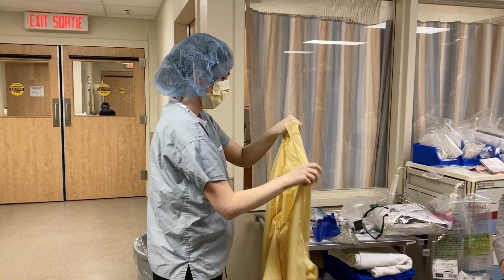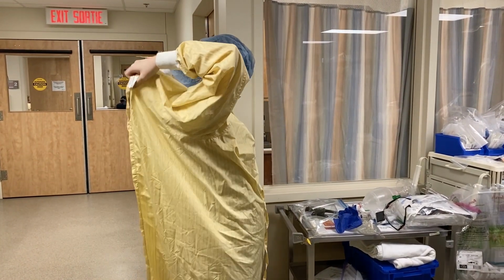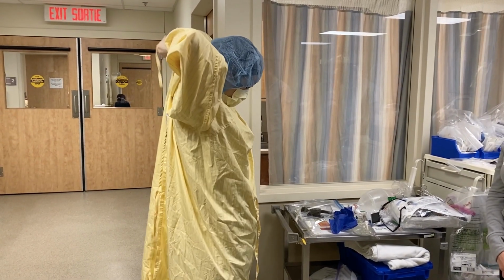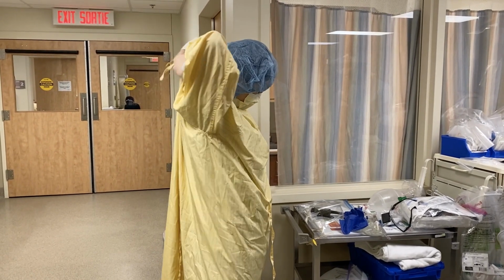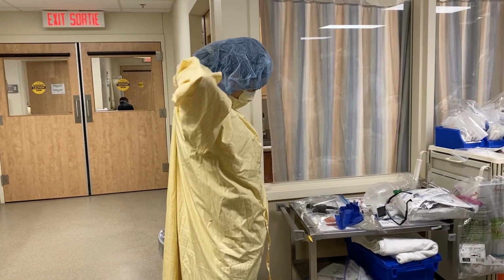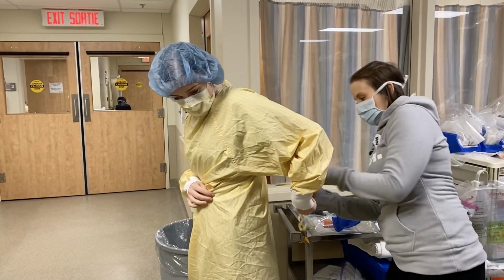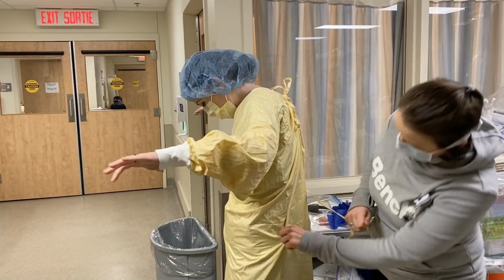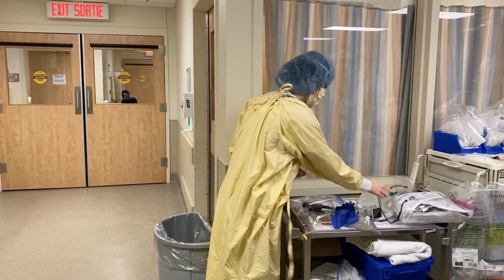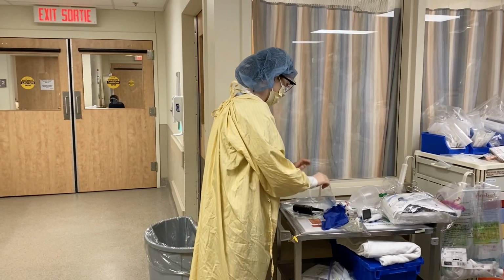For video and simulation purposes, we are using the reusable gowns as you see here in the video. If this were a real-life situation, we would recommend a level 2 disposable waterproof gown. It's good to do this at whatever institution you work at to discover whether you're long-armed or broad-shouldered to make sure you fit the gowns properly. There's no tie. Okay. Well, let's pretend your back is... you're good. It's tied. And that just highlights the example of why it's good to try the gowns on to make sure all the ties are present.